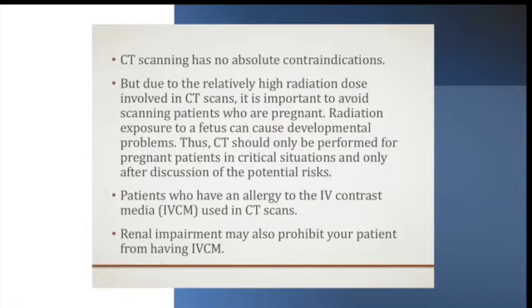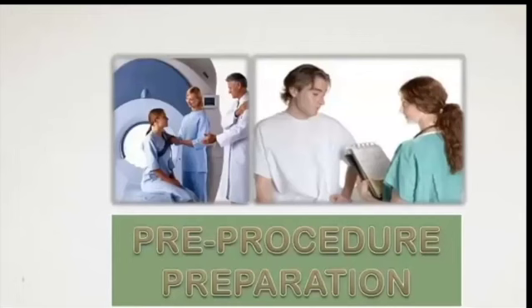So be reminded that we may use contrast for certain indications. However, we usually avoid contrast, or we always avoid contrast in cases of renal insufficiency or allergies. Now, for a patient to have a true allergy to contrast is quite rare. Most patients will have what we term a pseudo-allergy. Contrast doesn't really cause allergies except in a handful of patients.